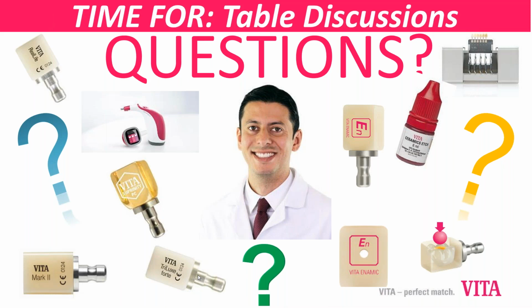So thinking about this situation during the preparation appointment, using your prep guide and checking the thickness, not only for creating the space for the material, but also thinking about the need to slightly mask, will help you a lot. And then if you use the VITA materials, of course, with the VITA shade guide, you don't have any risk of losing information when we jump from one shade system to another.